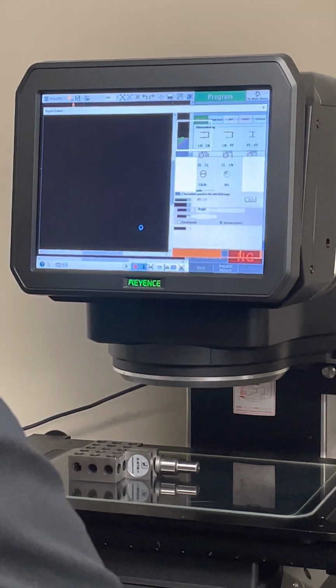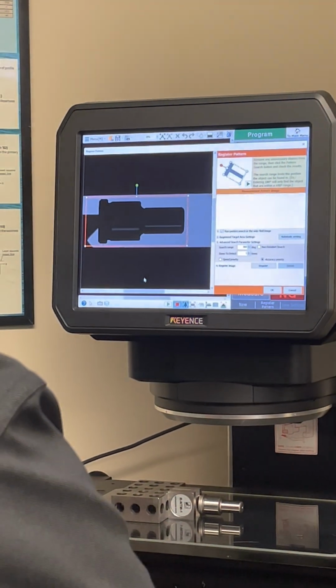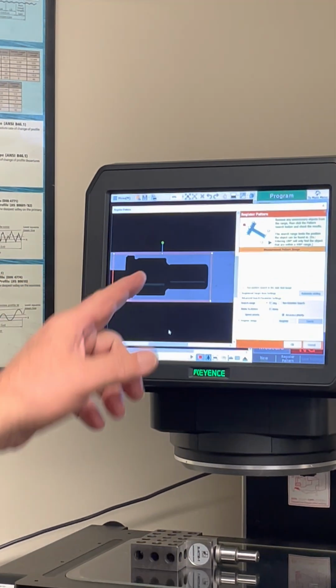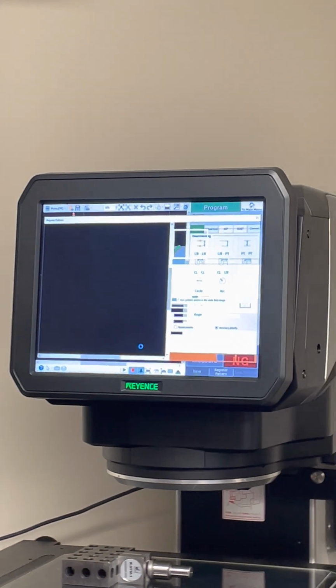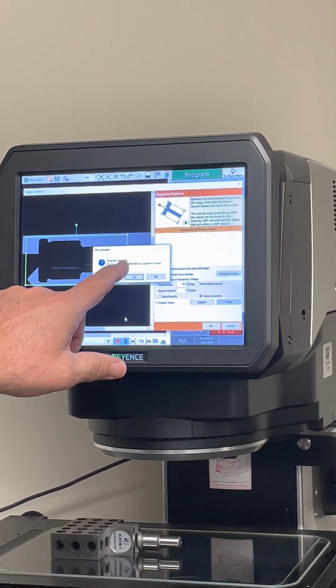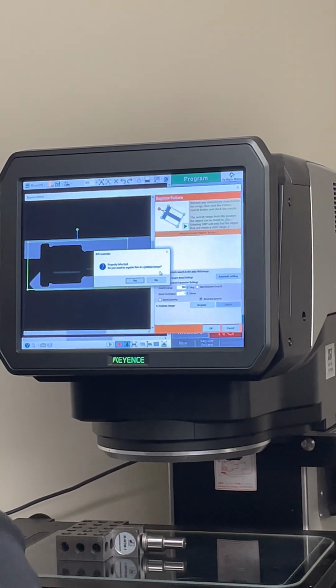Because if you don't, you can't save it or move it around. That's correct. I'm going to say no here for a reason. Basically what happened was this. I'm going to cancel. When I go to register the image, if the system says, I think this is good registration, which it does, says properly detected, do you want to register this? I'm going to say no right now, and I'm going to show you why.